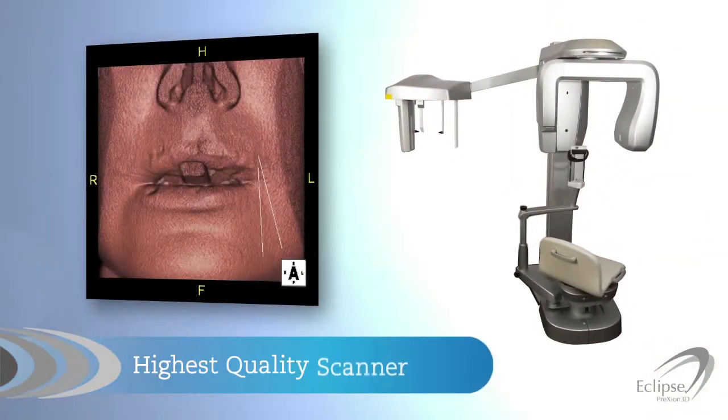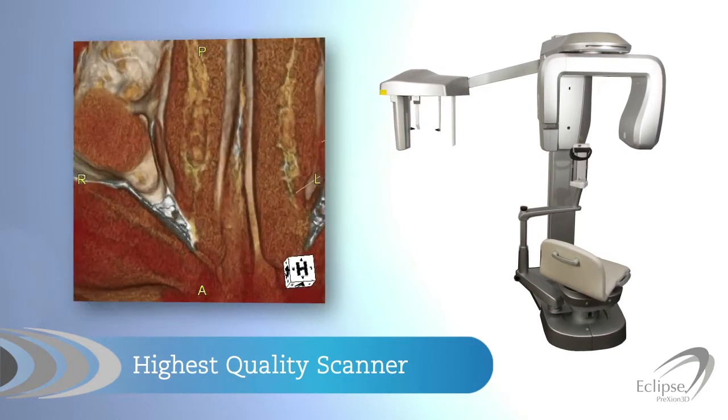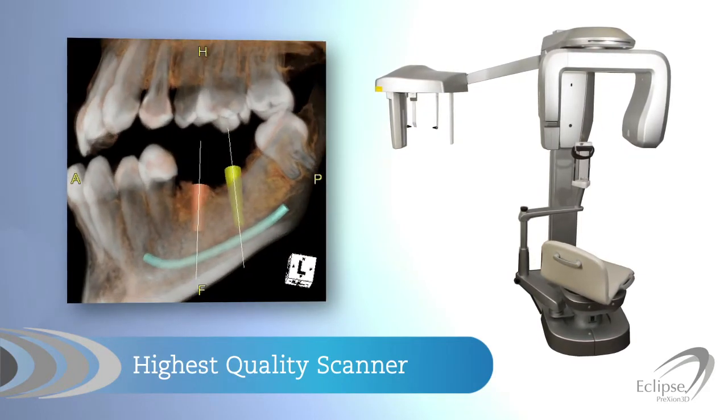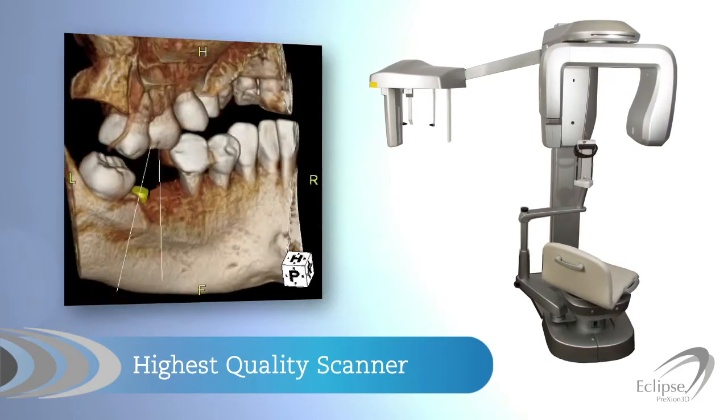The Eclipse gives you more flexibility with a dedicated panoramic, optional CEPH, and highest diagnostic quality 3D CBCT scanner on the market. It's supported by our powerful yet easy to operate 3D viewing software.